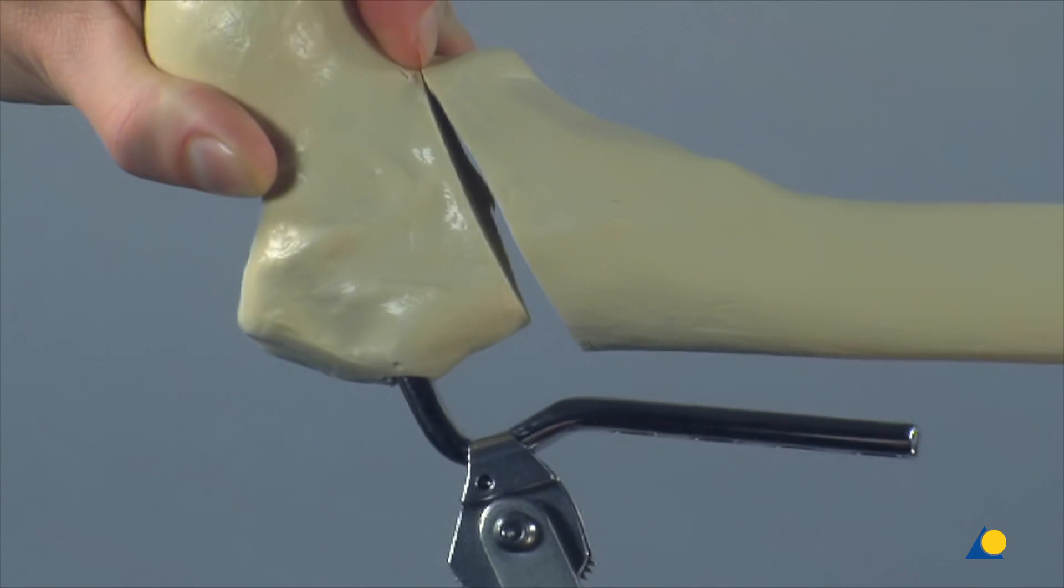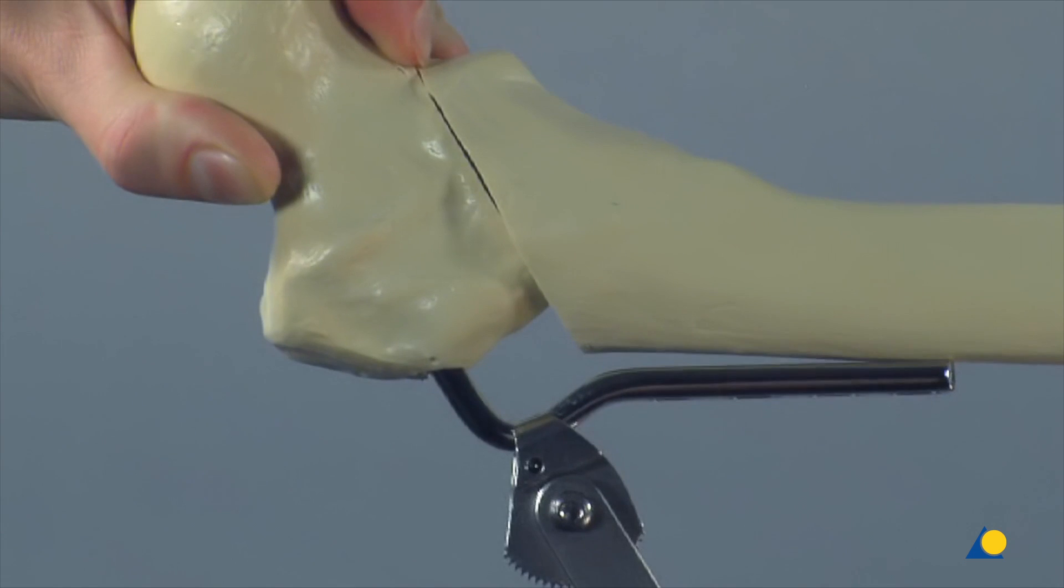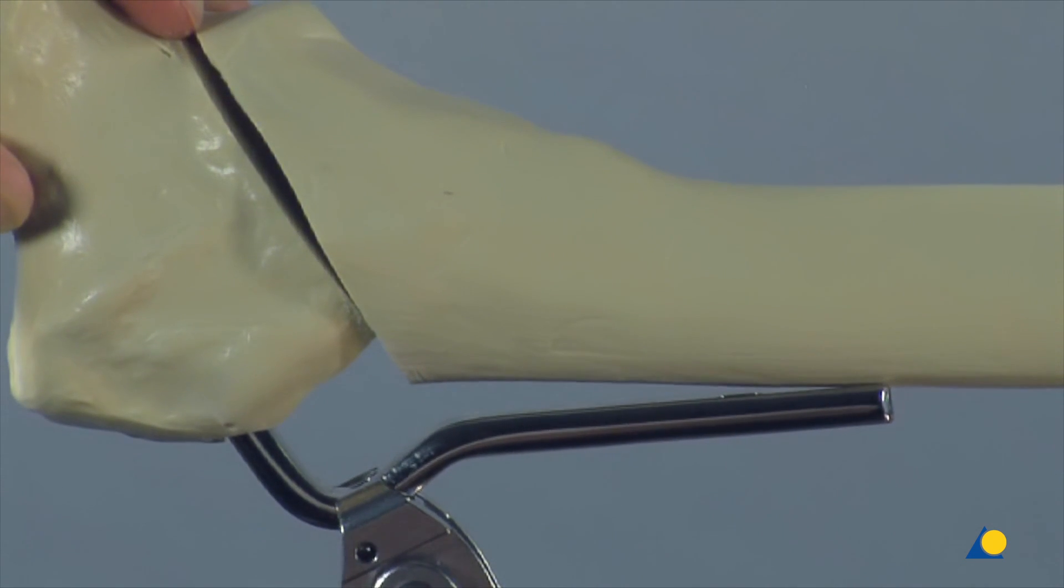The two oblique osteotomy surfaces are brought together, leaving a 3 to 5 millimetre gap between the lateral cortex and the plate at the distal osteotomy cut.